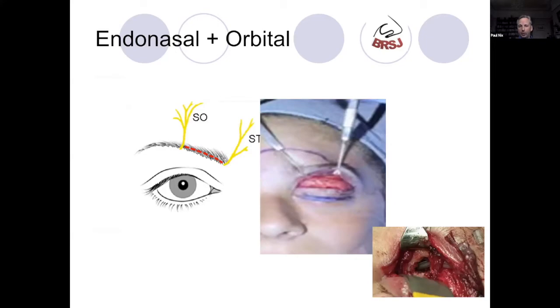I'm going to have my endoscopic approach through the nose, but I'm going to open up a lateral port through an eyelid incision in the floor of the frontal sinus laterally, so I can pass instruments or the camera from the lateral aspect, as well as have access via the nose medially. If I've got the opportunity, I'll typically ask my ophthalmology colleagues to help me out, because they are very good at doing a lovely lid incision, which is very cosmetic when it heals up, and they can gain me access to the floor of the frontal sinus laterally.